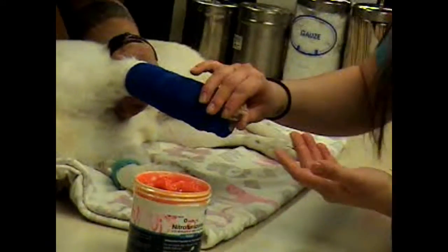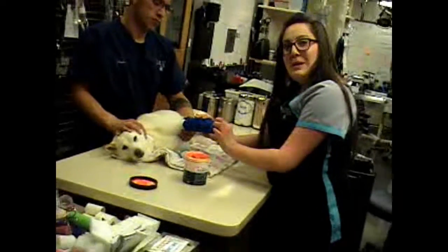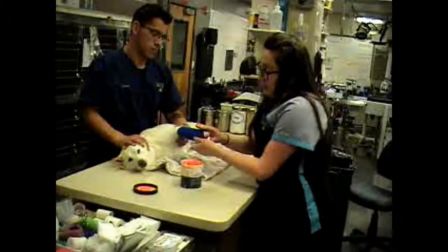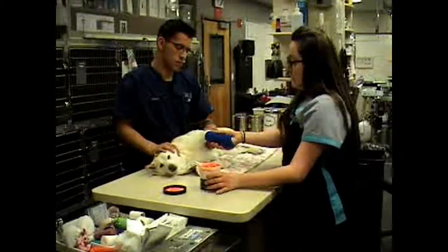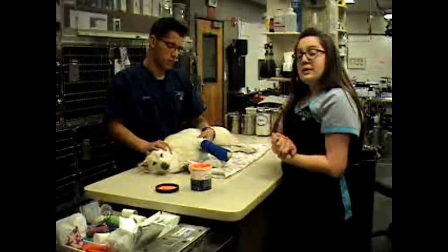We can still see the toes at the bottom, so we'll still be able to evaluate whether we put this bandage on too tight. We'll fill in between those toes and make sure they're nice and warm — we can also assess if they're really super swollen or not. This bandage will stay on pretty well with those stirrups. The dog can still walk and use its toes and we can still see everything, but it's all set to go.